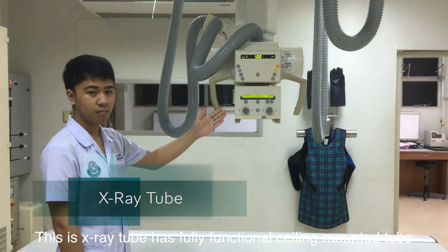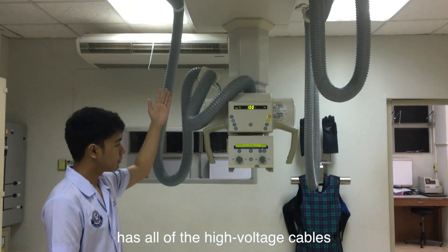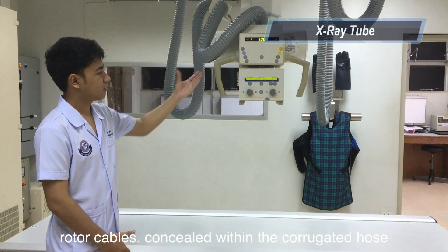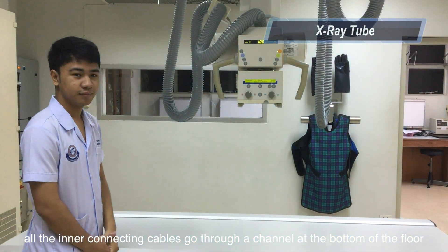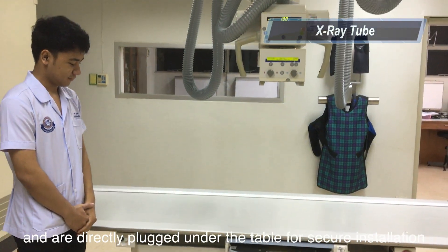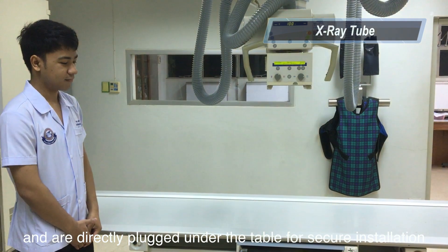This is the X-ray tube. It has a fully functional ceiling mount tube with all of the high-voltage cables and supply cables concealed within the corrugated gated hose, or the interconnecting cables go through a channel at the bottom of the floor and are directly plugged under the table for secure installation.